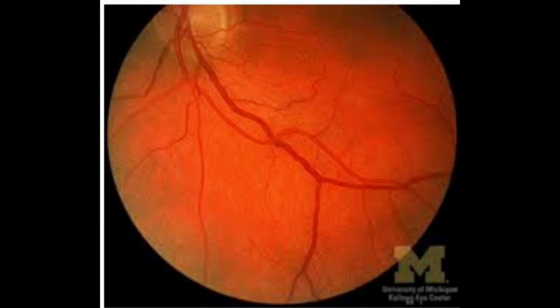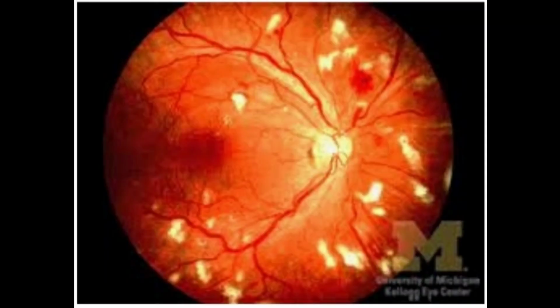Now that you've seen the normal eye, I want to go over some of the common things that you may see in practice as well as boards. This image comes from the University of Michigan, also a great image. And this is a picture of AV nicking of the eye. So it's simply what it says. The arteries are nicking the veins. And this comes from having hypertension uncontrolled for a long period of time. But if you look, you'll see where the smaller arteries are overlapping the veins and causing them to nick and separate and bulge.